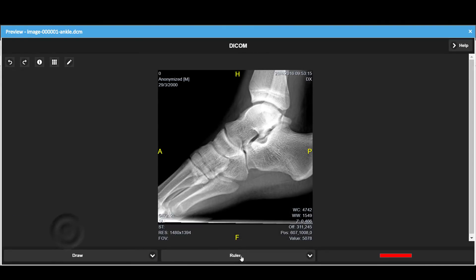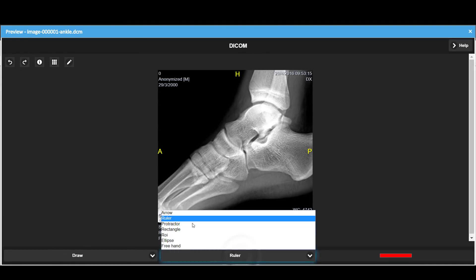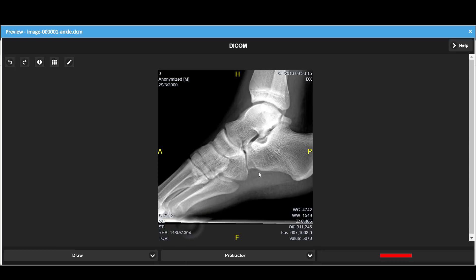Now we select the protractor and measure an angle.